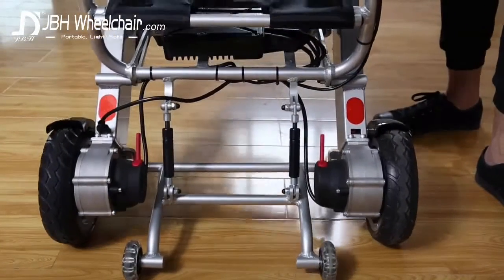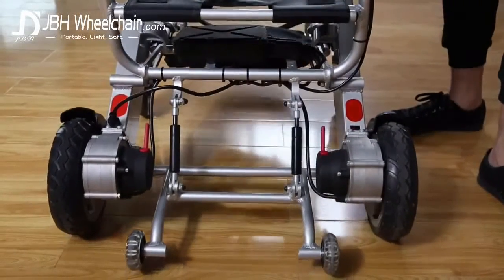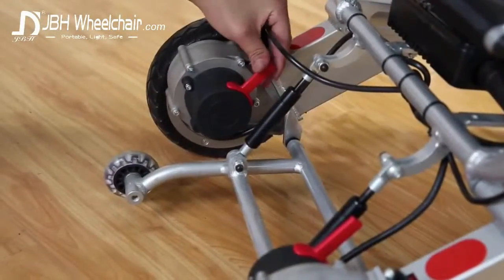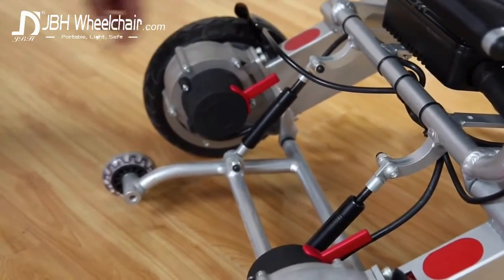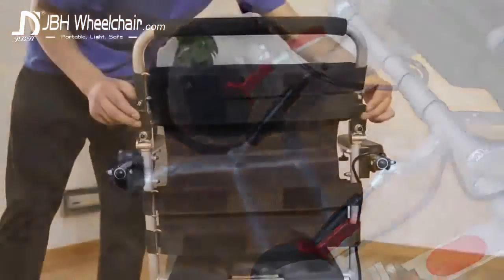No fear of tipping backwards thanks to the mini support wheels. You can see that no wiring hangs close to the ground. The back wheel brakes can be fixed manually too. In fact, this wheelchair may be used as a manual or an electric wheelchair — or both. It's up to you.